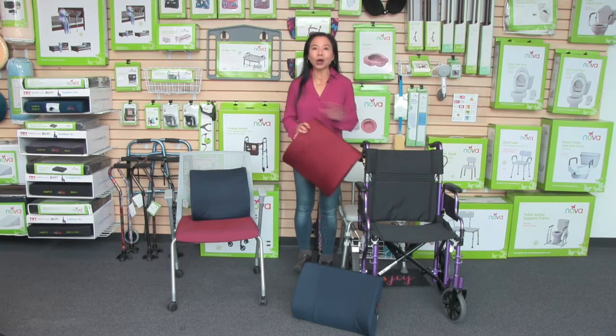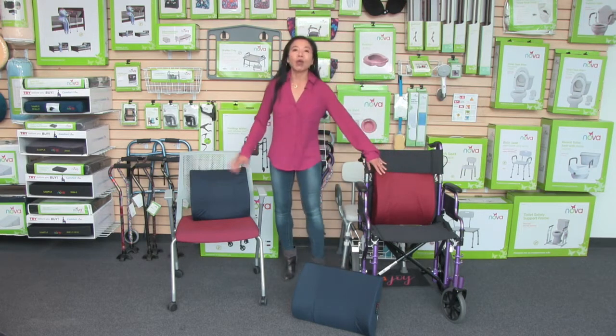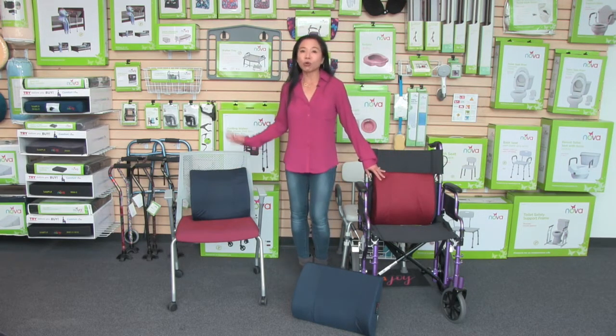I recommend it for all of your seats, so it's great for a transport chair or wheelchair, and also your everyday office chair, home chair, or even a car.